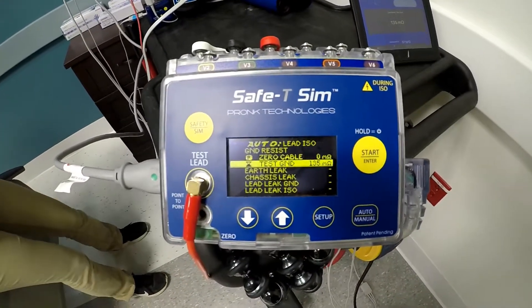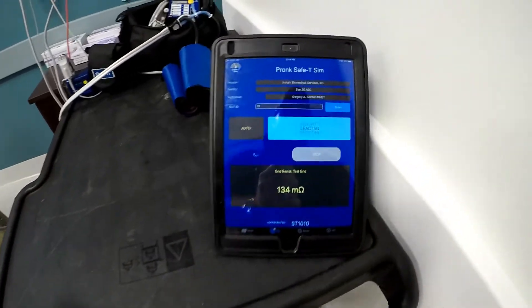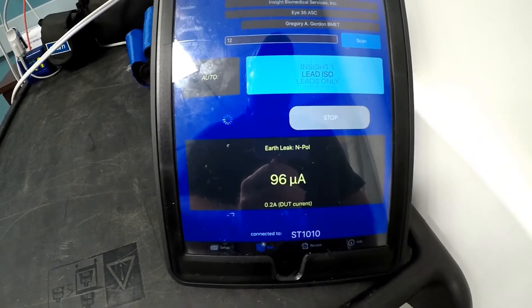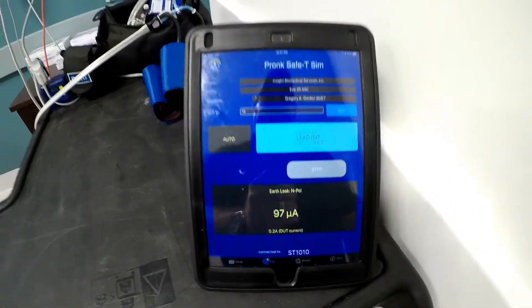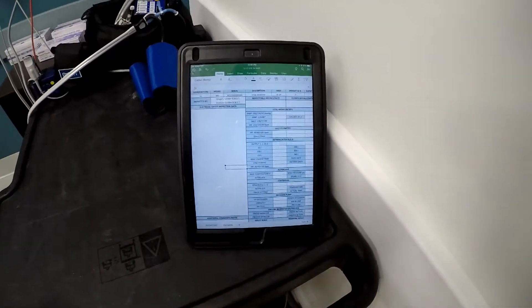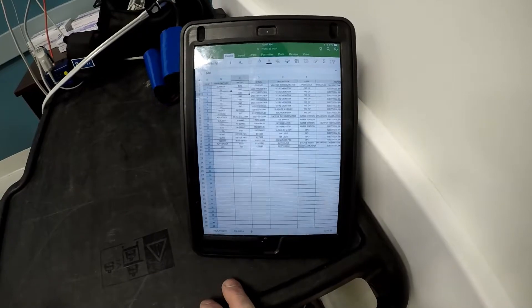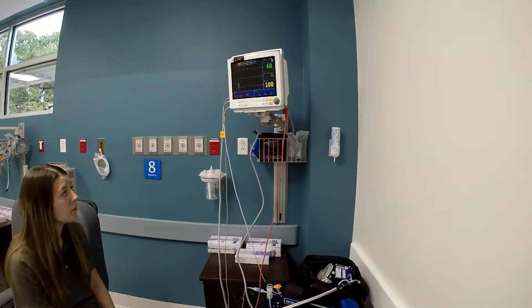The Safety Sim automatically takes over. So while all that's going on, normally we'll be typing in other control numbers, models and serial numbers on our inspection list — kind of get ahead of the game for the next test. And Madison can be hooking everything up.